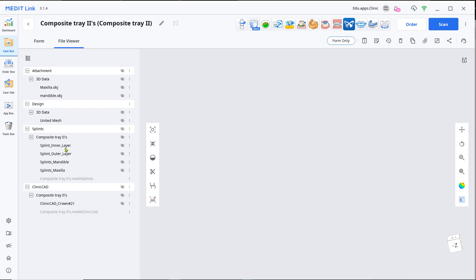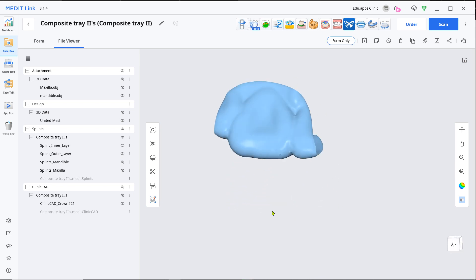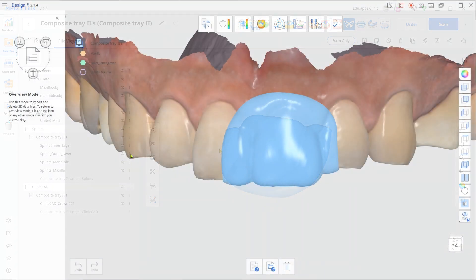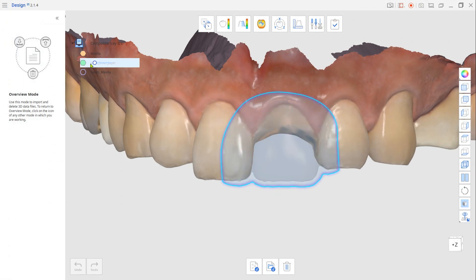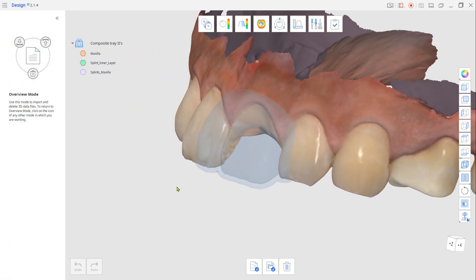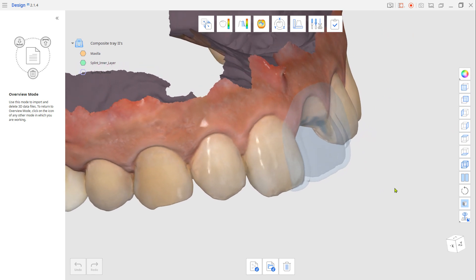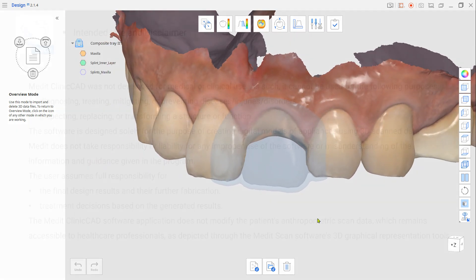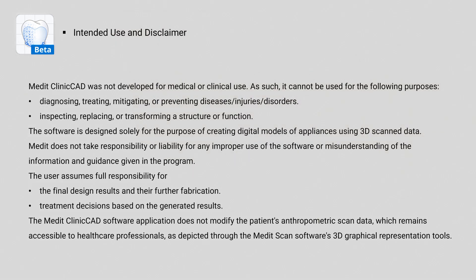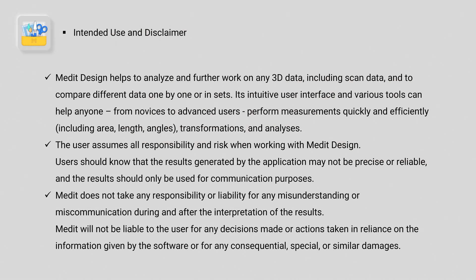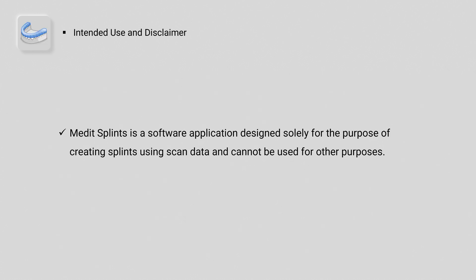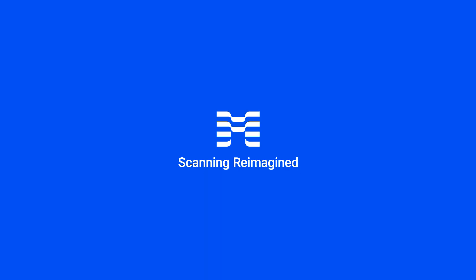Now you have an inner layer splint that will be the composite tray for the missing teeth. Thank you.